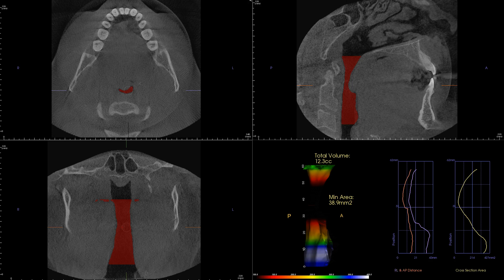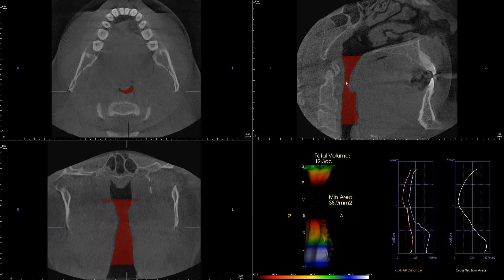Hello everyone. Today I would like to show you another case with very interesting airway morphology. I'll cut to the chase and show you the axial view of the patient's airway.